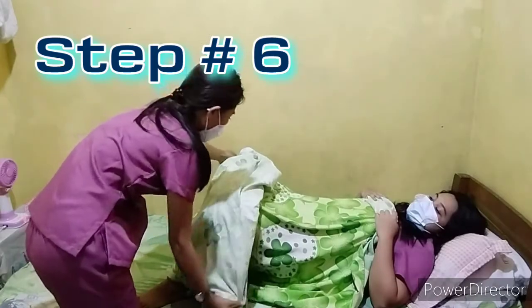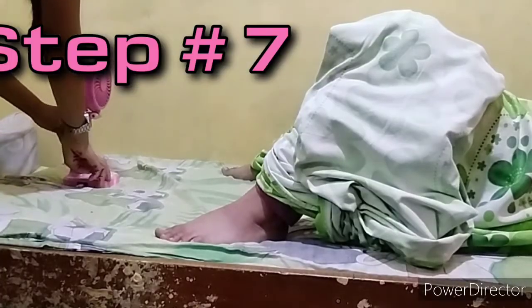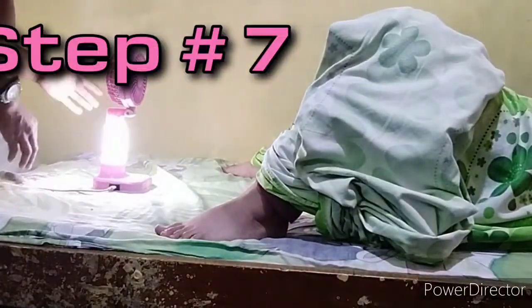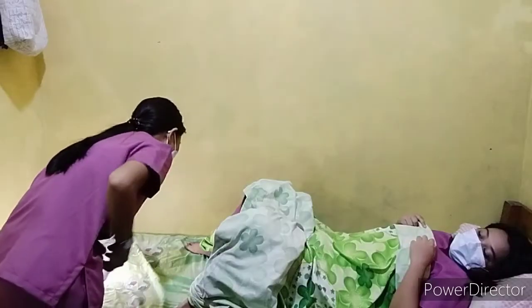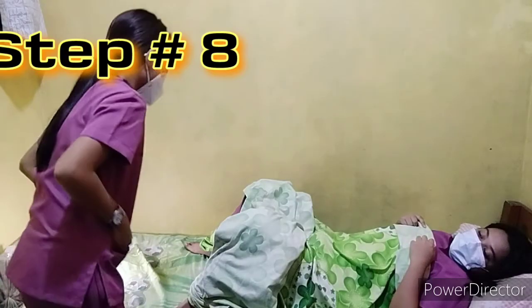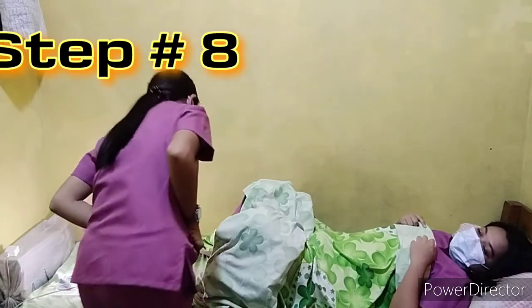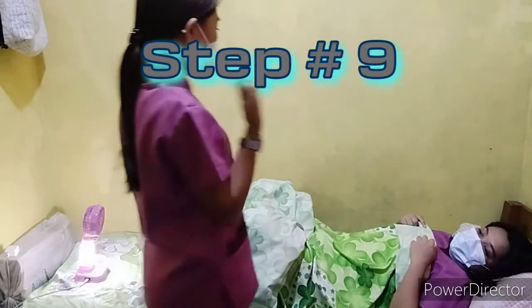In step number 7, place the lamp 18 to 24 inches, 45 to 60 cm, from the patient. If the lamp is any closer, it could burn the patient. For step number 8, check for any discomfort, burning reaction, or other untoward reaction. Frequent checking will prevent complications. Do not leave an irrational patient alone.